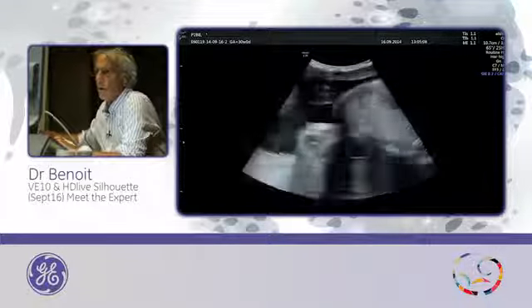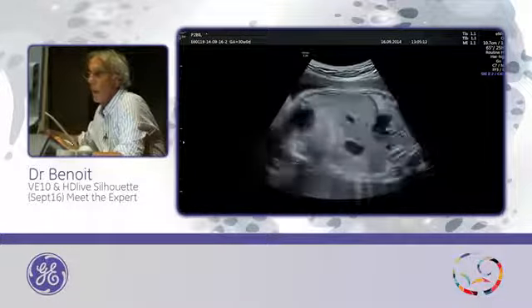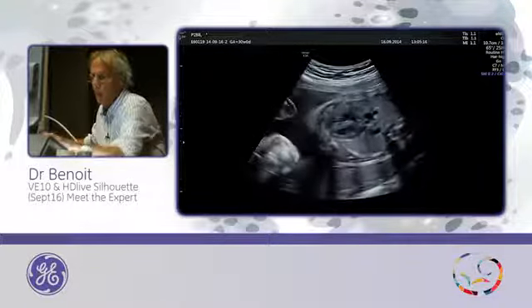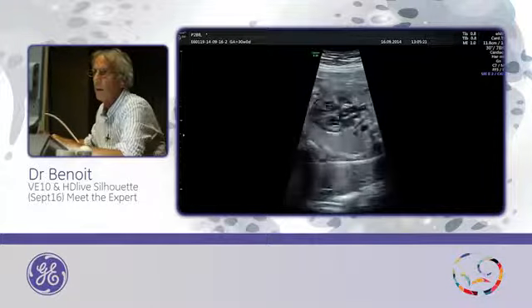So what else can I do? Yeah, we can do a real time 4D on the fetal heart when you have the four chamber view. Yes, so I will go with the cardiac settings here. This is a cardiac setting.